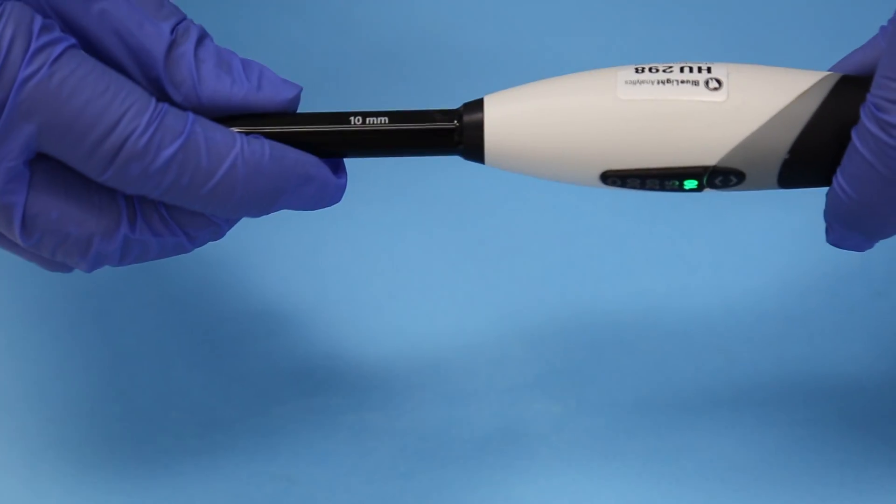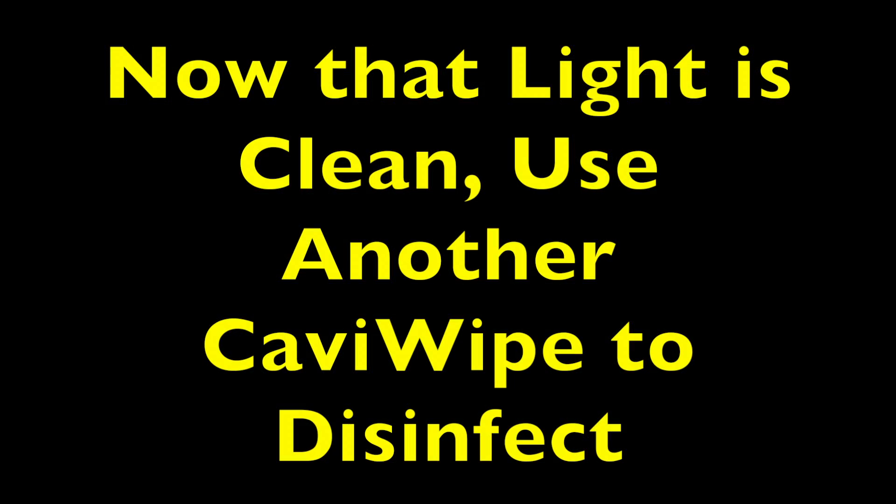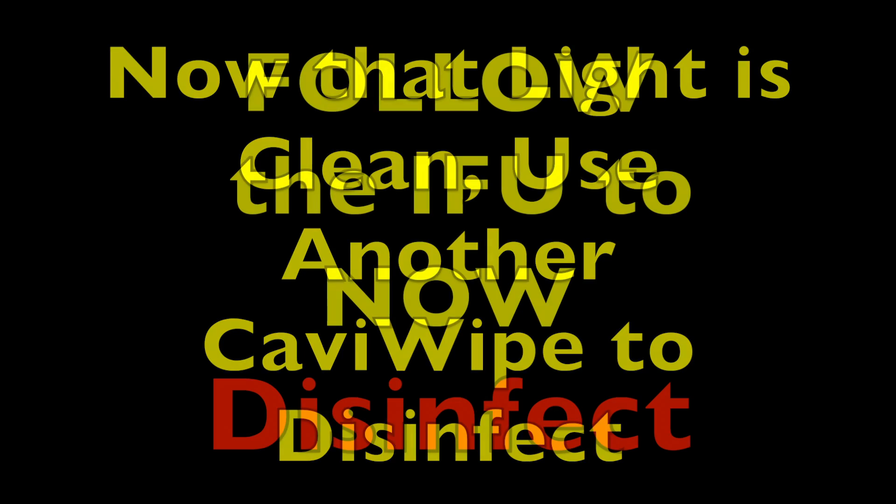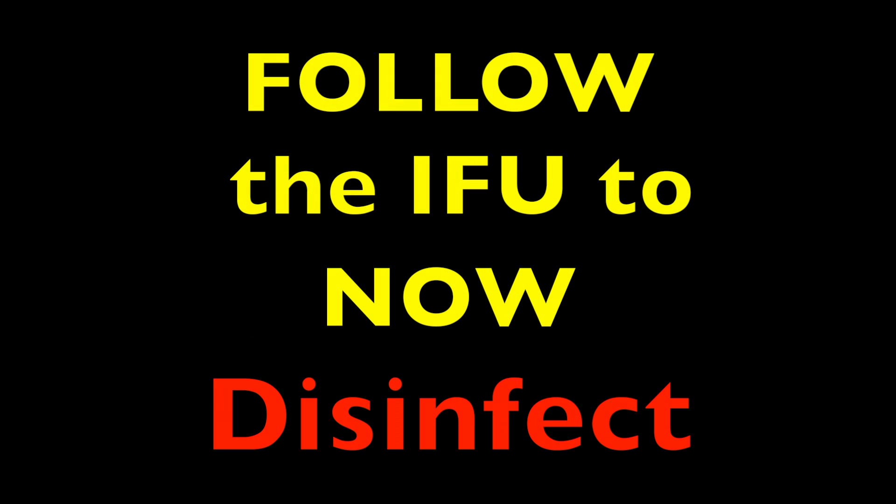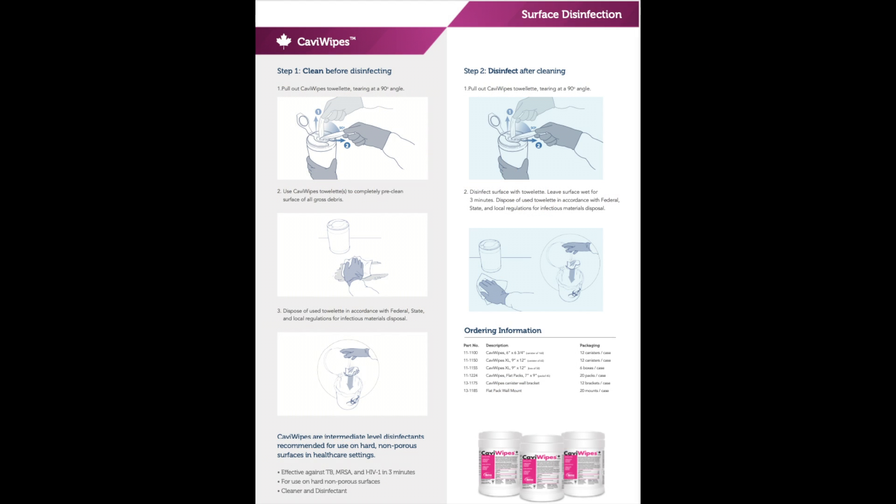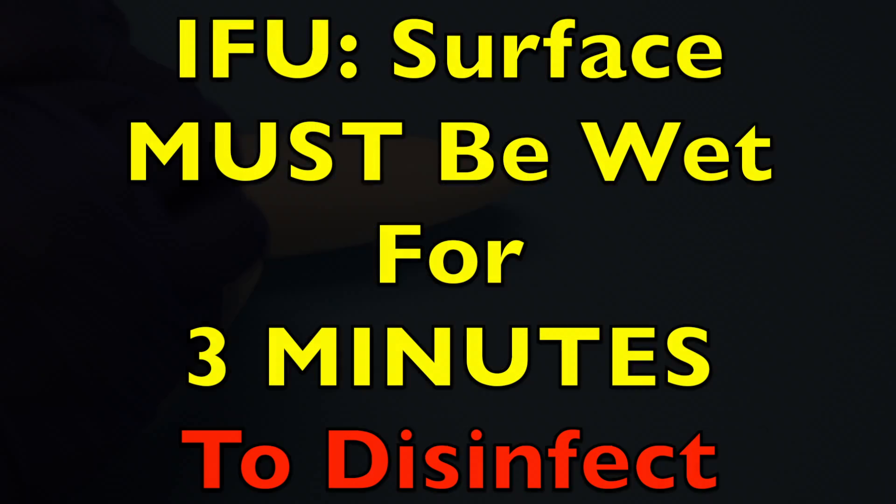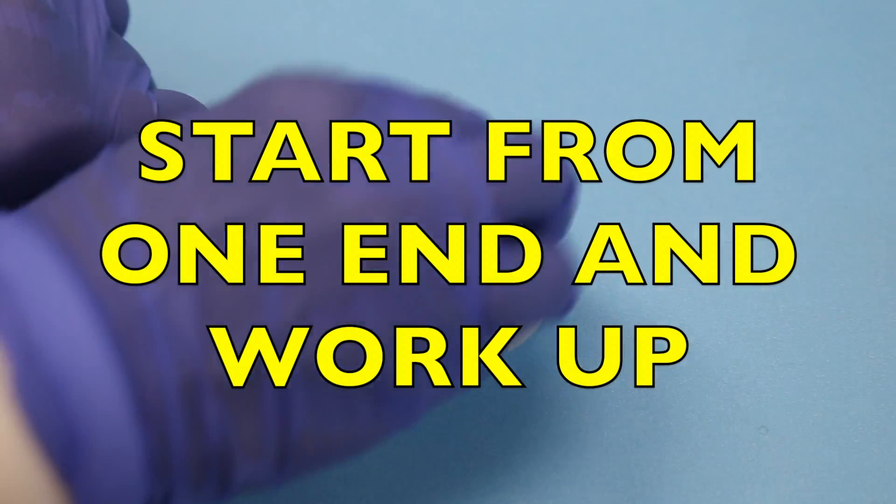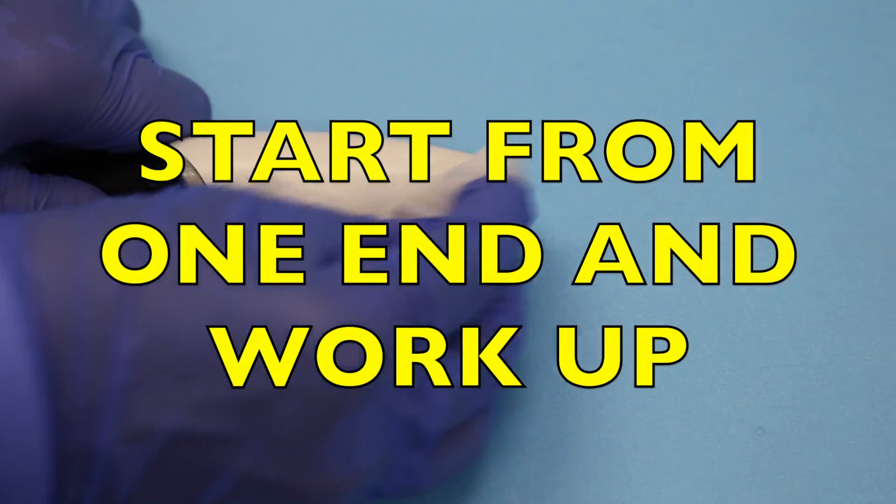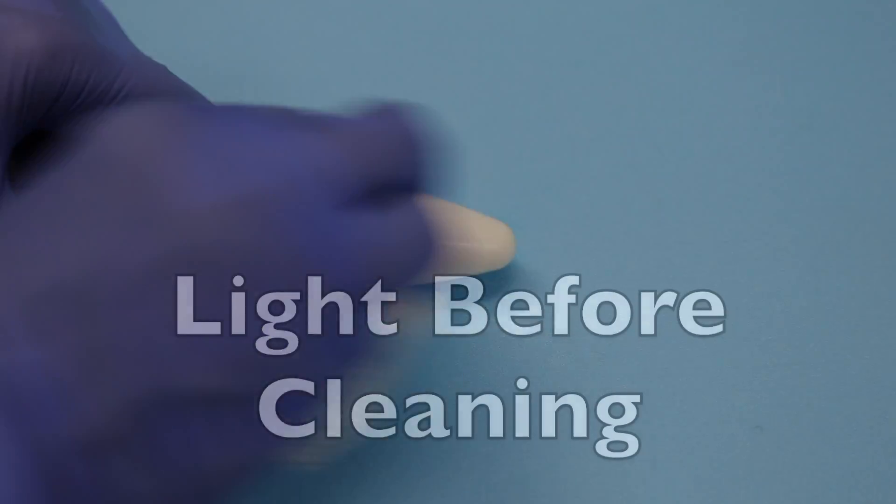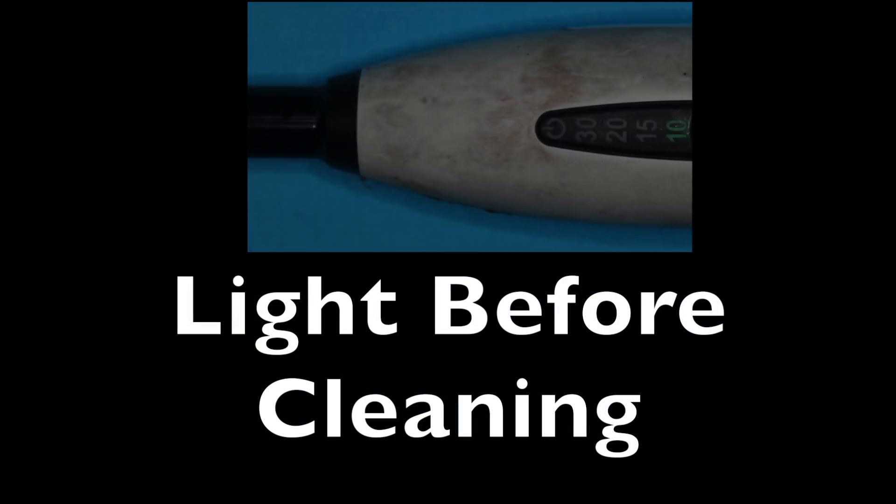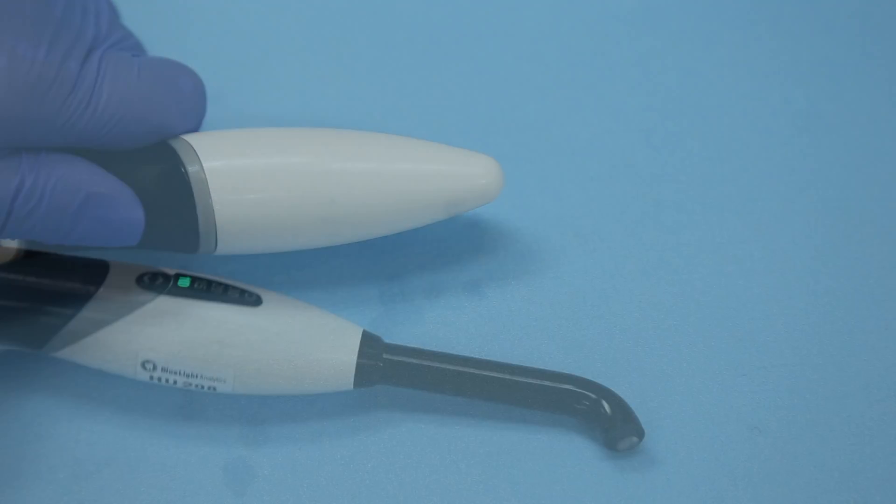Now that the light is clean, it's ready to be disinfected. Always follow the instructions for use and make sure that the surface is left wet for the recommended amount of time. In this case, three minutes. So once again, we'll start from one end and work our way up. And at the end of all this, the light that was once dirty, such as this, is now clean like this.